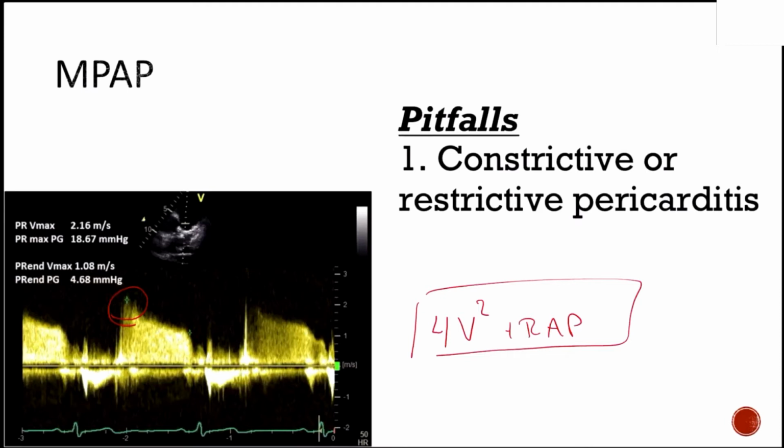But now we have another component, which is this pericardium, which is constrictive, and therefore our pressures inside are going to be very different than our pressures outside. No longer can we assume that they're under the same pressure system. Now they're under two different pressure systems. So that's going to alter the flow through your tricuspid, through your pulmonic regurgitation, because you're now going from something outside of that restricted chamber to inside that restrictive chamber, and you can no longer assume a pressure similarity between the two. Does that make sense? Okay.